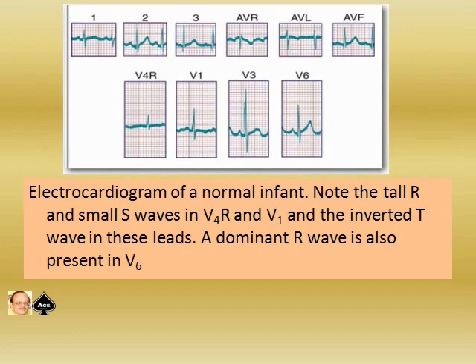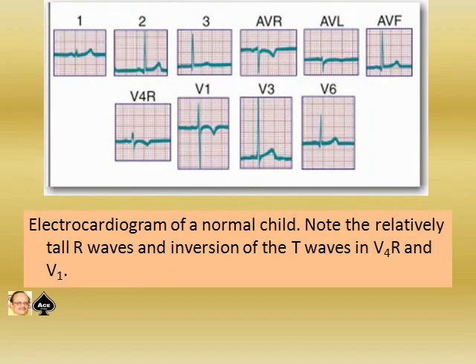The electrocardiogram of a normal infant is shown here — please see the picture carefully. Note the tall R and small S in V4R and V1 and the inverted T in these leads. The dominant R-wave is also prominent in V6. The ECG of a normal child is also shown here. Note the relatively tall R-wave and the inversion of the T-wave in V4R and V1 again. These are all normal.